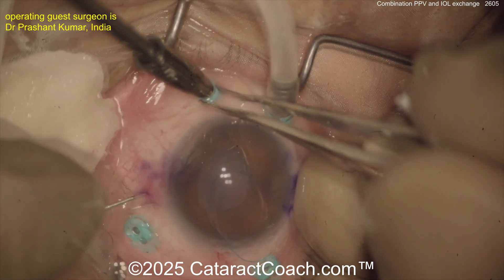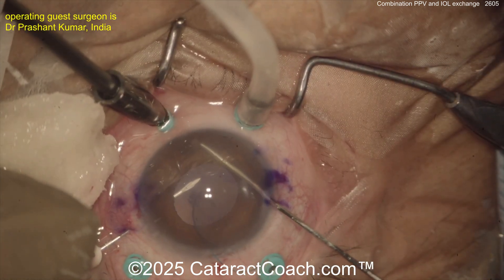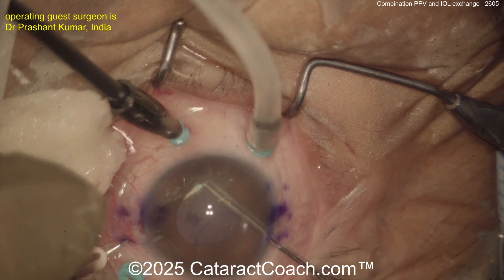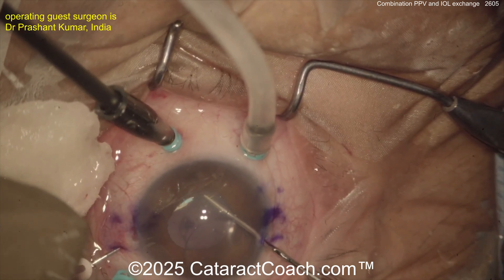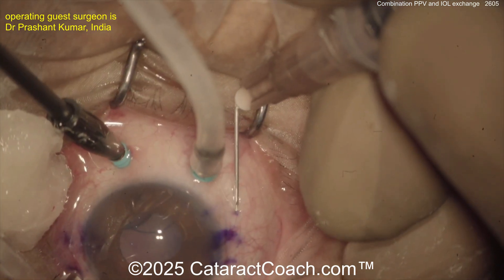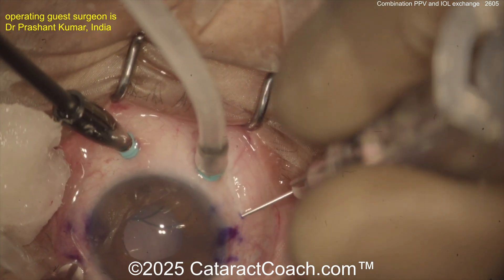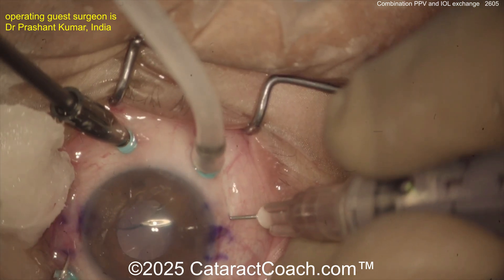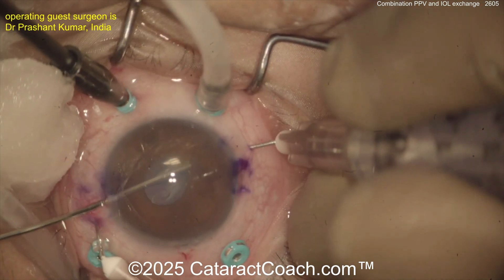One of the key things here is, rather than moving the haptic towards the needle towards the central visual axis, bring the needle towards the haptic. The haptic is what you're worried about — this looks like a PMMA haptic, and you don't want it to get kinked or damaged. So just bring the needle to the haptic rather than forcing the haptic towards the central visual axis. I've seen cases where these PMMA-type haptics can actually fracture. Look how far back in the vitreous cavity the IOL optic is sitting — this is exactly why you need that full vitrectomy done when performing these manipulations.